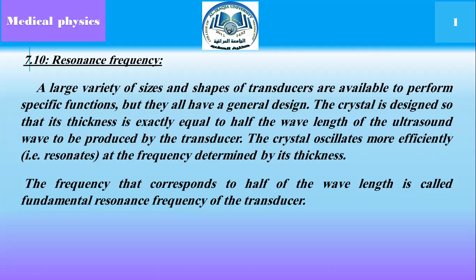أهم شرط هو أن يكون سمك البلورة مساوي لنصف طول الموجات الصوتية التي ينتجها من محول الطاقة. The frequency that corresponds to half of the wavelength is called the fundamental resonance frequency of the transducer.